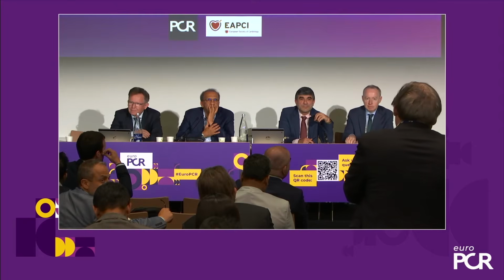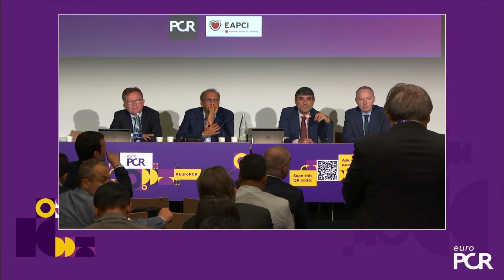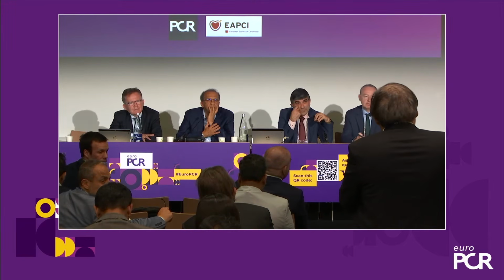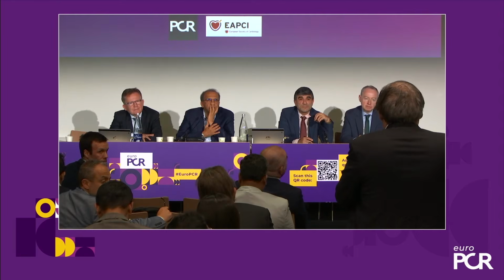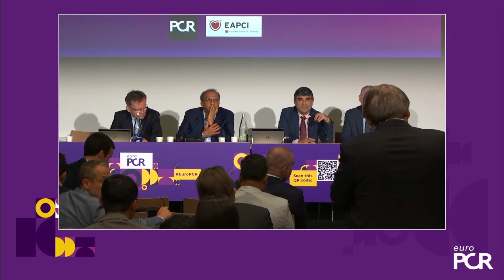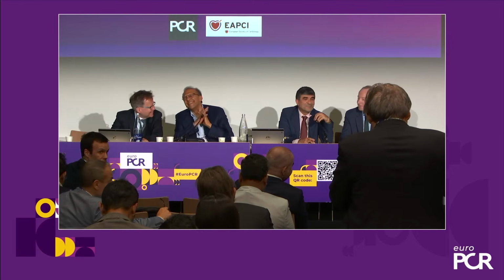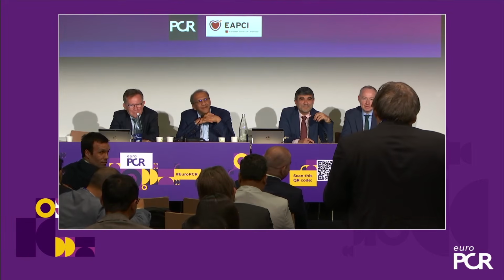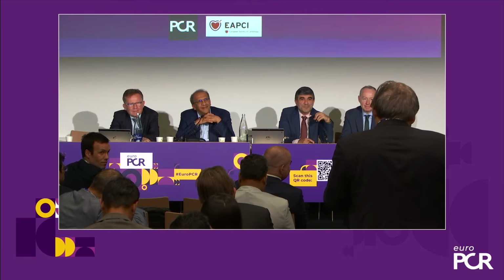Try to open with another, a 2 millimeter balloon, but it never happened that I used laser for a lesion that would not cross. Laser is the best, after me, who performed this method and used it, but I stopped because the company was not good. Because I have great experience in interventional cardiology, the best method is laser.